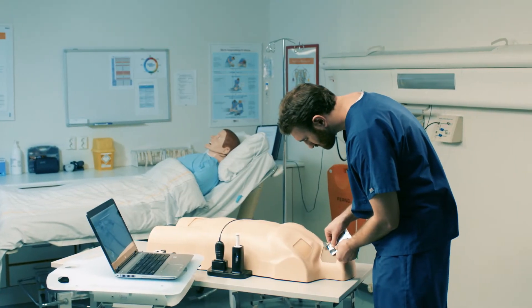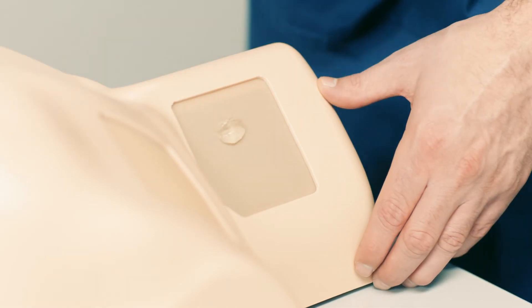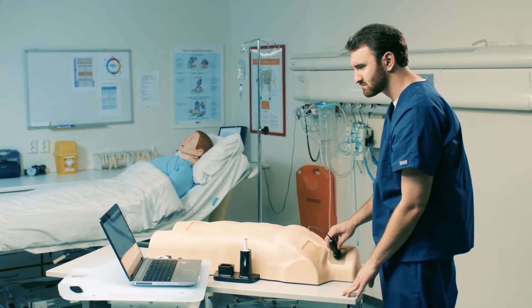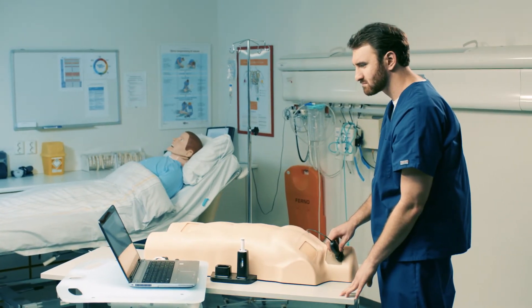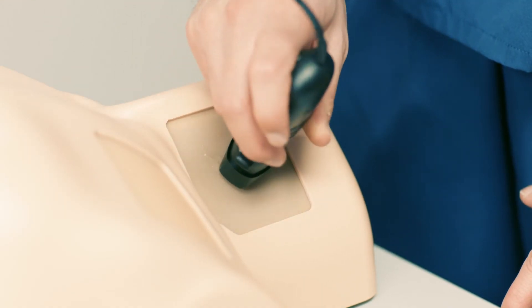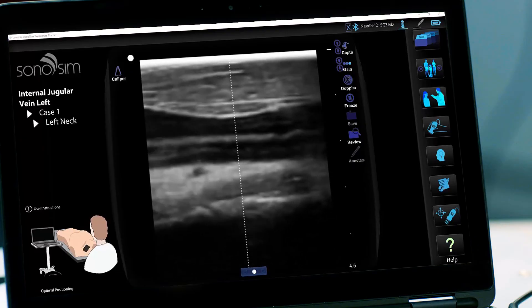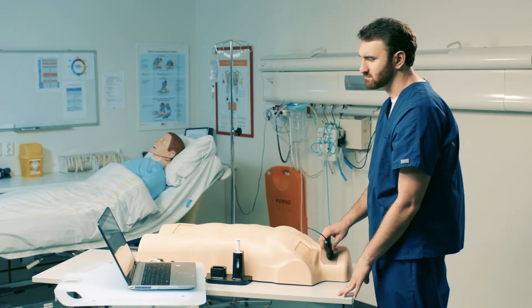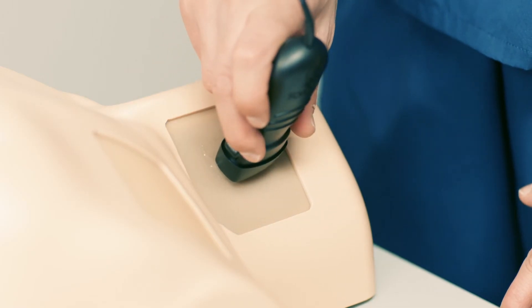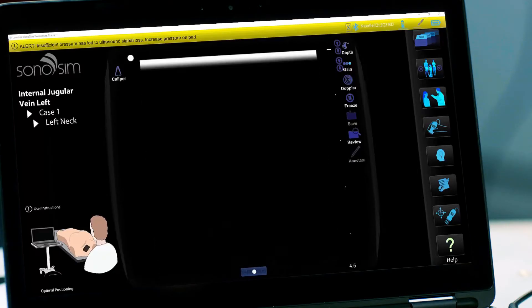Apply a small amount of gel to the trackpad — no more than the size of a small coin. To start scanning, place the probe on the trackpad and scan as you would on a real patient. The ultrasound image on the screen will correspond with your probe movements on the trackpad. Maintaining adequate pressure on the trackpad is required during scanning. A message will display if pressure is inadequate.